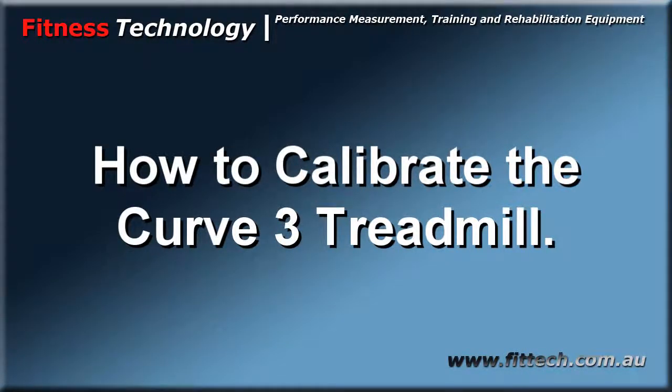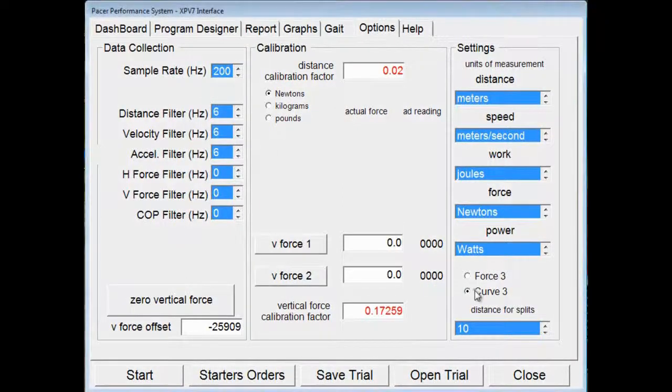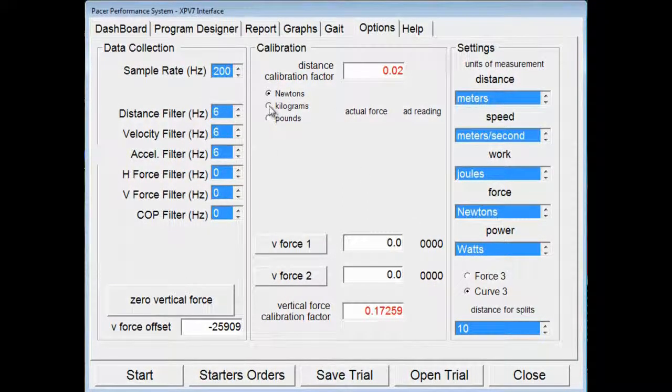We are now going to go through the process for calibrating the Curve 3 treadmill. First you go to the options page, click on Curve 3.